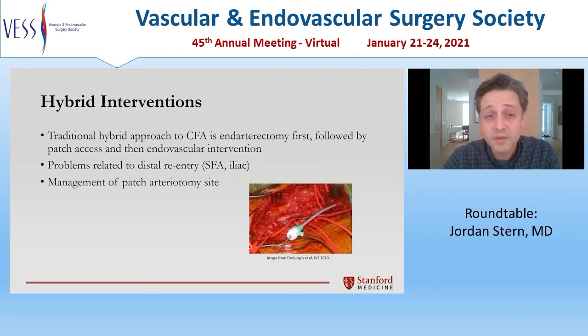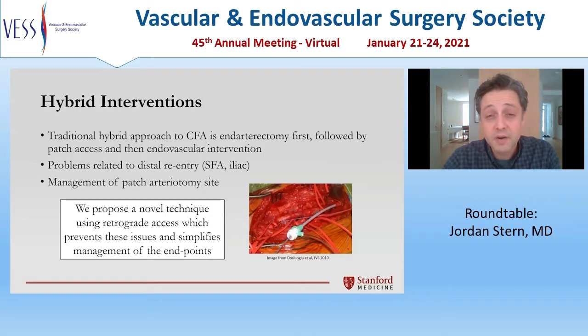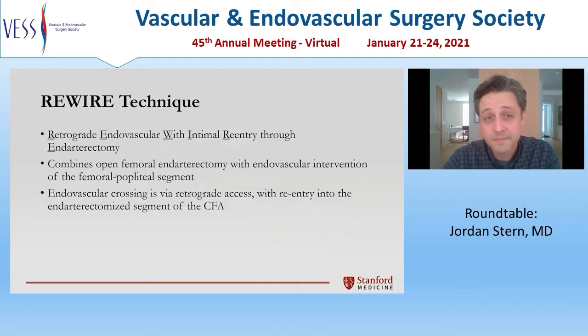Problems can arise related to distal reentry in either of the adjacent vascular beds. There are additional issues that may arise related to access sites and controlling the patch arteriotomy. We propose here a novel technique that uses retrograde access, which prevents some of these issues, particularly related to the endpoint, and simplifies management. The REWIRE technique, or retrograde endovascular with intimal reentry through endarterectomy, combines open femoral endarterectomy with endovascular intervention of the femoral popliteal segment. Endovascular crossing is via retrograde access with reentry into the endarterectomized segment of the common femoral artery, which mitigates some of the issues related to reentry.